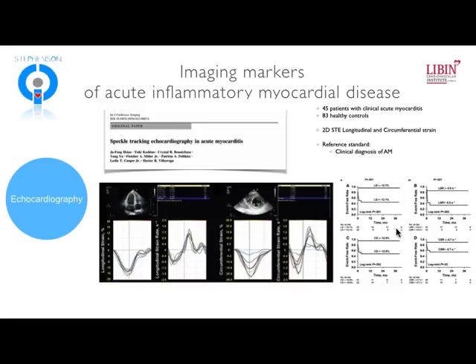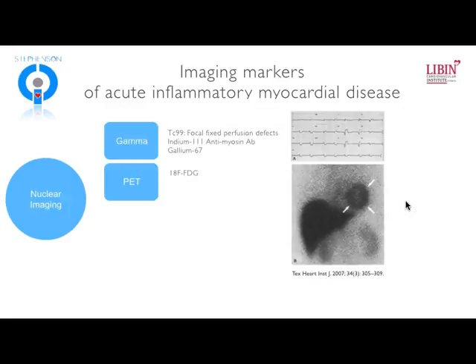In that study, they were able to identify that those patients that had normal versus abnormal strain profiles did seem to have a significantly higher event rate over the upcoming 36 months. This was adjusted in multivariable analysis for baseline ejection fraction. And so it did seem to suggest that strain metrics may have the capacity to identify people at elevated risk of events following the suspicion of acute myocarditis.